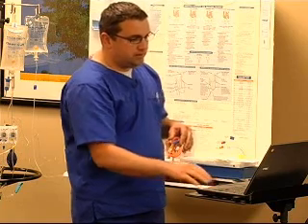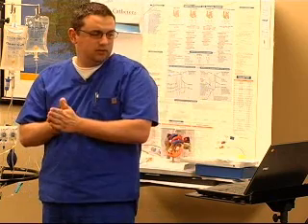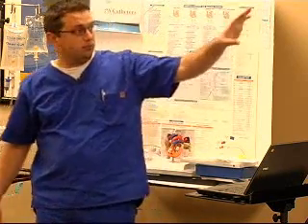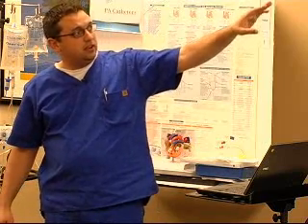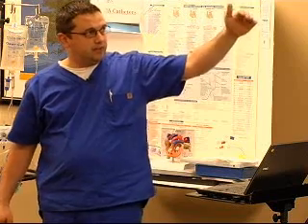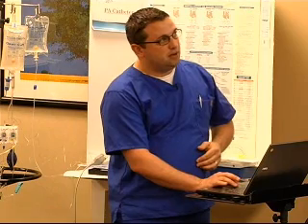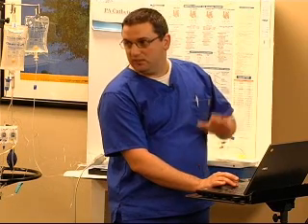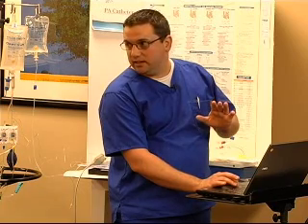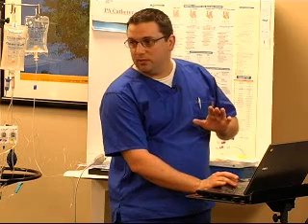All right. So here's a couple other examples, waveforms, these are actual ones, instead of the demo world. Thought we might give some more real-time examples here, but you can see there's some respiratory movement in there. So if this patient was ventilated, you would expect that your reference line, if this were a wedge, would be more towards the valleys if it was ventilated, in other words, okay? This is a representation of a PA, though, okay? You can see the PA waveform there.